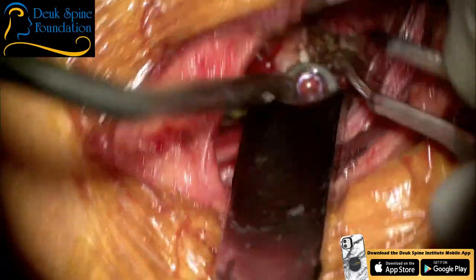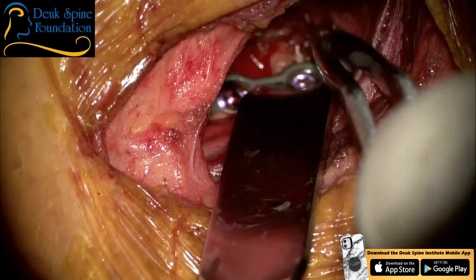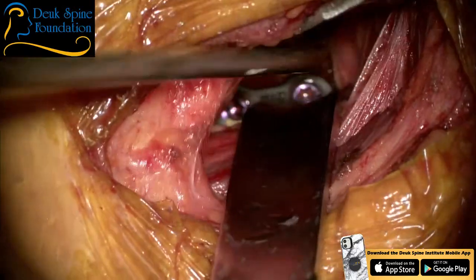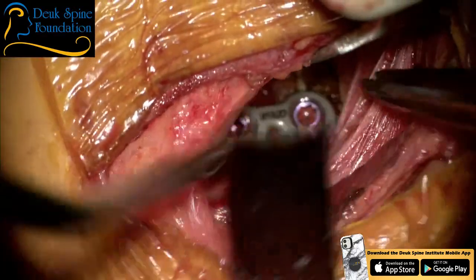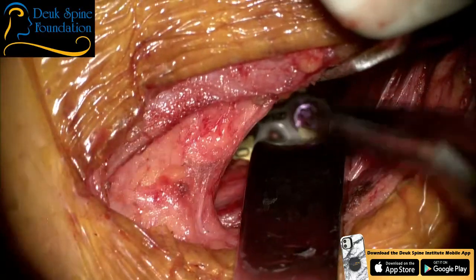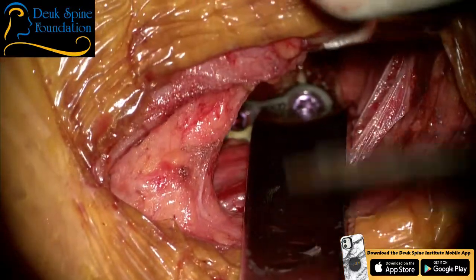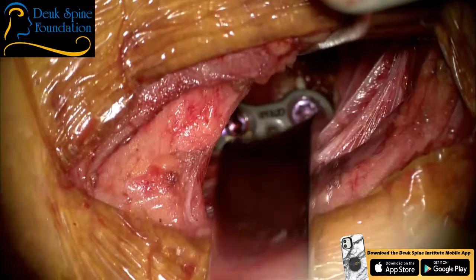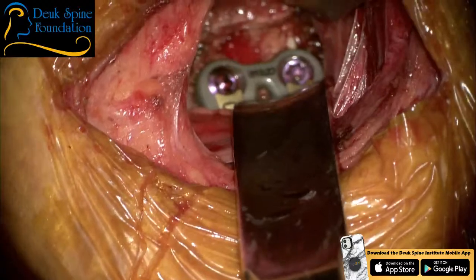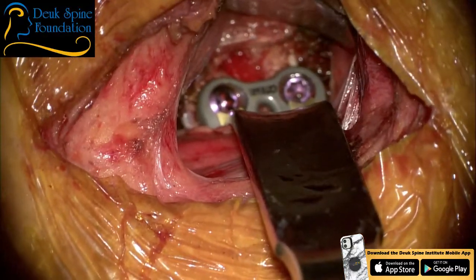It's like a teeter-totter, isn't it? Okay, I need to see right here. Right up here. There you go. See how there's a little bleeder in there? Suck for me. It's hidden. We've got to be able to see it. You want to try to re-grab and reposition? Okay. You're applying really good force, but look, just two fingers. Look at that. I'm not stronger than you. It's how you apply force. You see that?